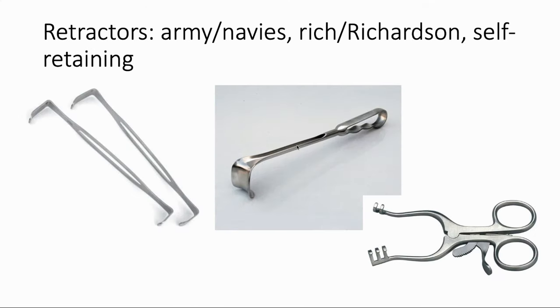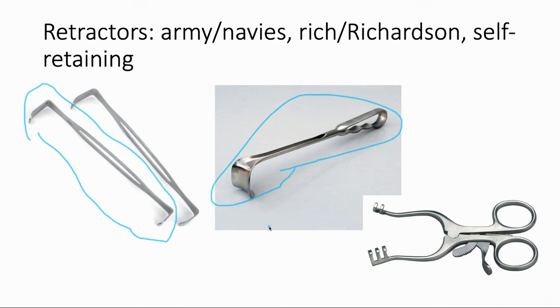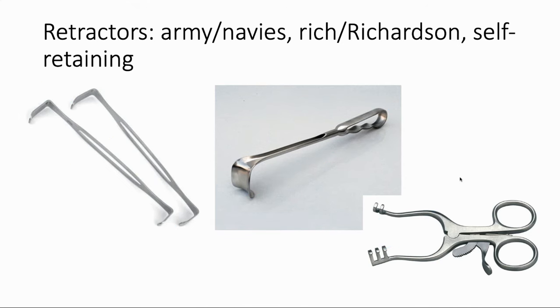Here are a couple of different examples of retractors — unfortunately you will probably have to hold a few of these as a medical student. The army-navies are simple, two-sided, relatively straight, and relatively small. The Rich or Richardson retractor is great for pulling into the abdominal wall. And here is an invention that helps medical students — it's a self-retaining retractor called a Weitlaner, where it actually locks into place and can do retraction for you and save some energy on your arms.